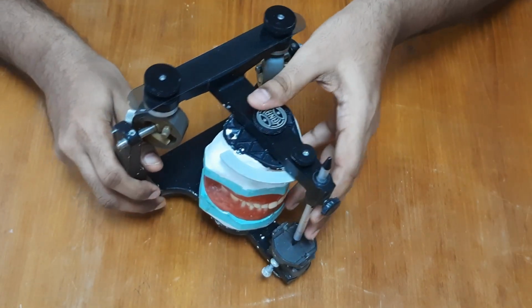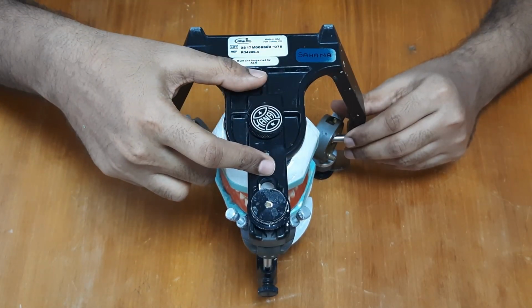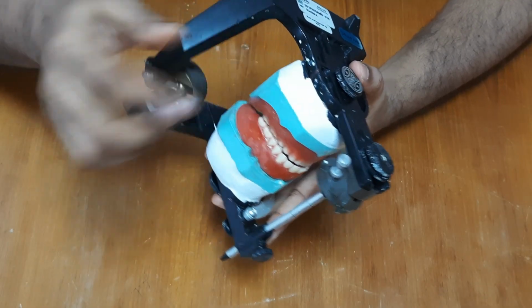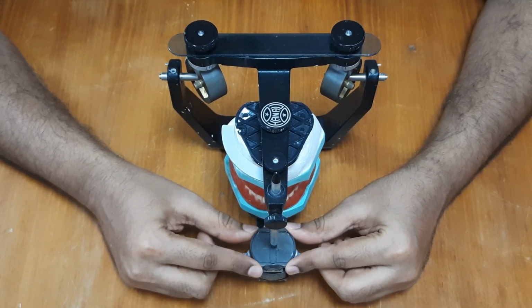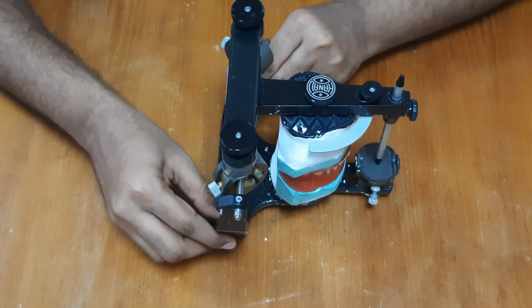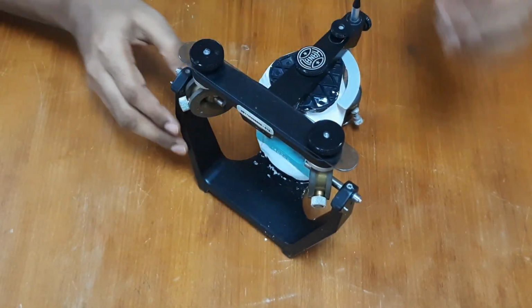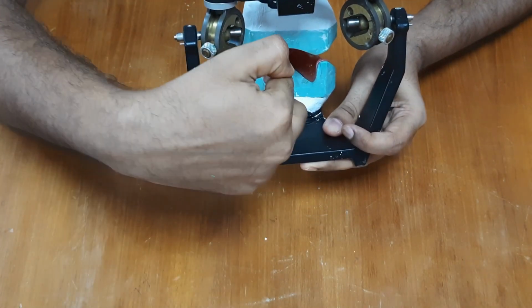Now we will look at the lower member. This is the lower member. At the center of the lower member is again a dowel used to attach the lower mounting plate. The incisal table is located in the anterior end of the horizontal arm. This is the horizontal arm. This is the vertical arm. It slopes outwards and gives a good lingual view.